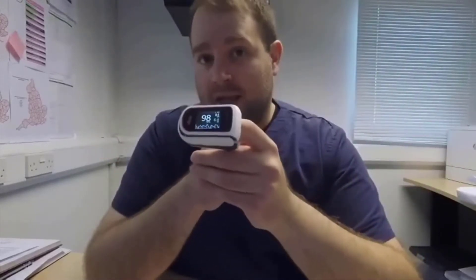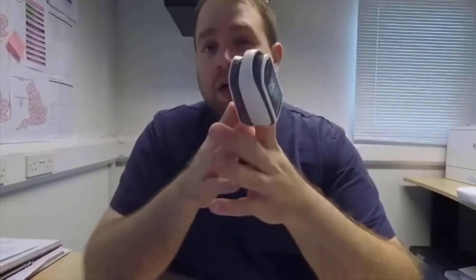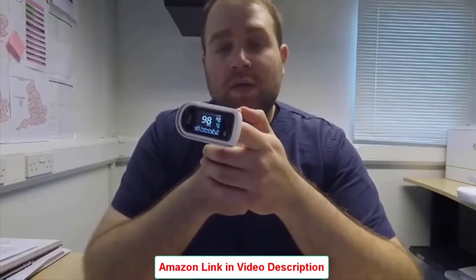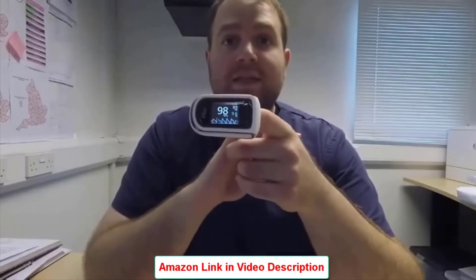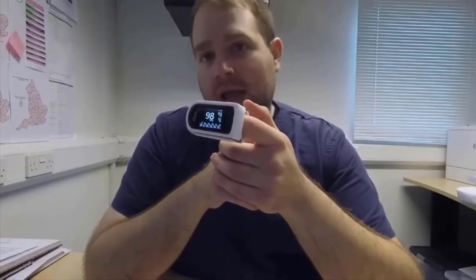Be aware that there are two different versions: one is the MightySat — which is this one — and the other is the MightySat Rx. The first one is meant to be used by everybody; the second is meant to be used just by health professionals. There are then three subversions: one is without Bluetooth, without pleth variability index, and without respiration rate; then there is this version which has Bluetooth but no pleth variability index or respiration rate; and then there is a third subversion that has all the optional features — pleth variability index, respiration rate, and Bluetooth. This is the middle subversion.